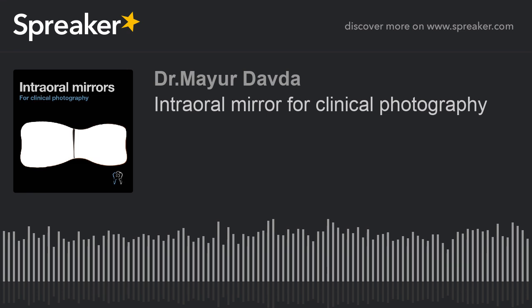If you've done documentation inside the patient's mouth, I would suggest that you should not scrub the mirror with any kind of cloth or even a gauze piece or even tissue papers for cleaning it. This is one of the reasons why whenever we sell mirrors to any client, we provide a microfiber cloth, which is an extremely soft cloth. This is the cloth that you can use for cleaning the surface of the mirrors if there's a splatter of blood or saliva. But after you finish documenting a case, you do not need this particular cloth.